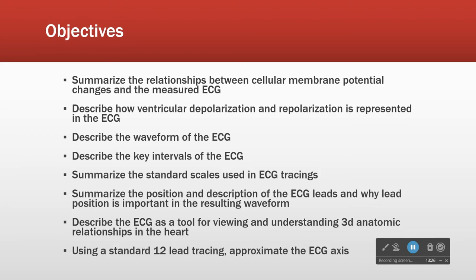It's easy to measure electricity, right? The meters are cheap, wires are cheap. So the EKG is a relatively inexpensive way to evaluate the heart. And it does so by looking at how the electricity is moving through that system.